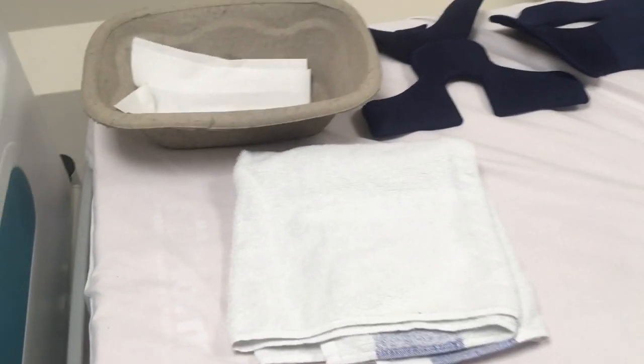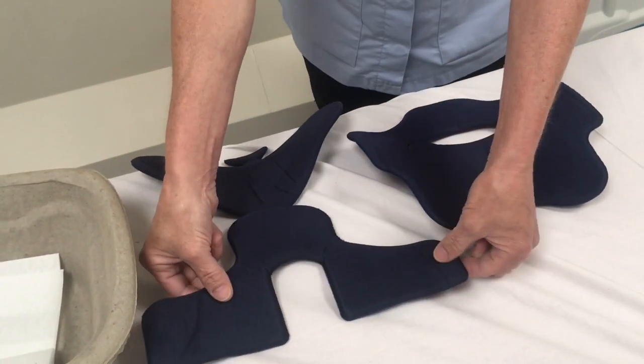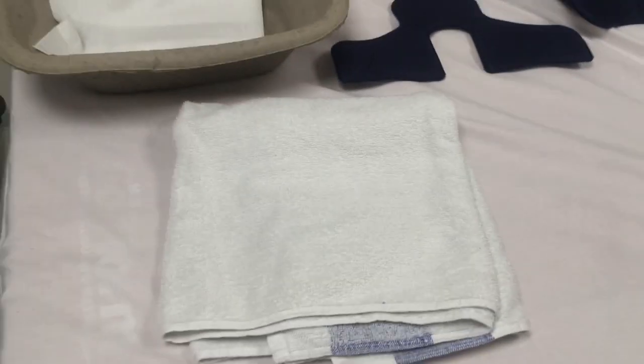For collar care you're going to need a bowl of warm water and some wipes. Have the clean and dry liners laid out separately and make sure you have a towel for cleaning and drying the neck.